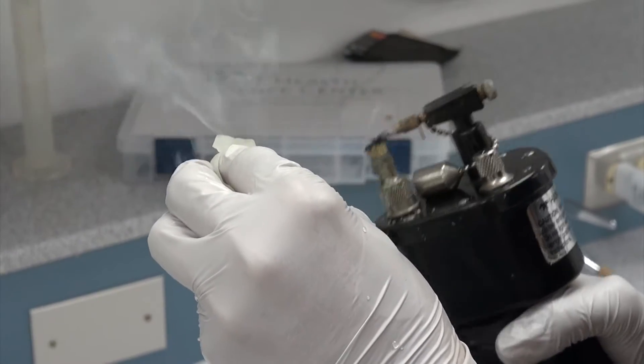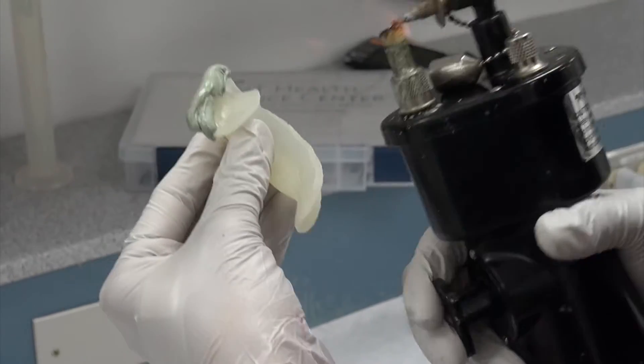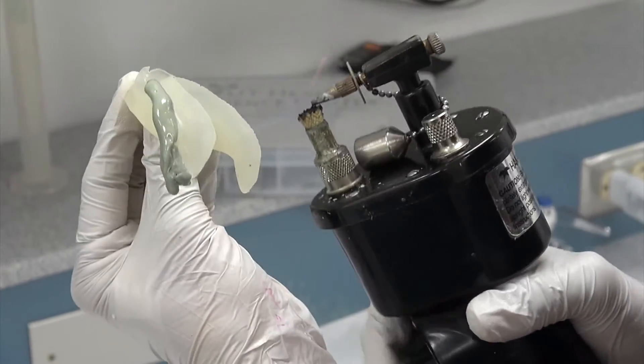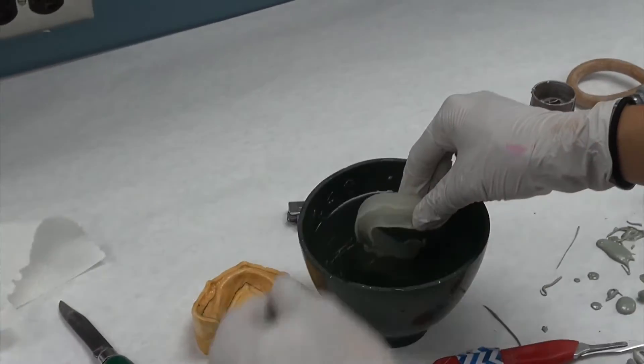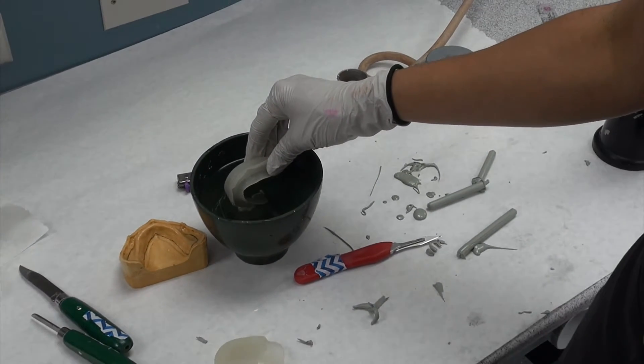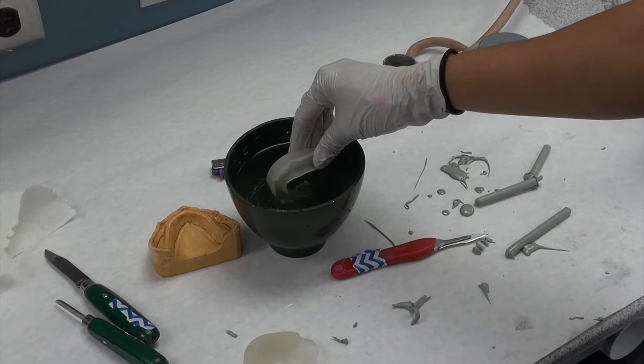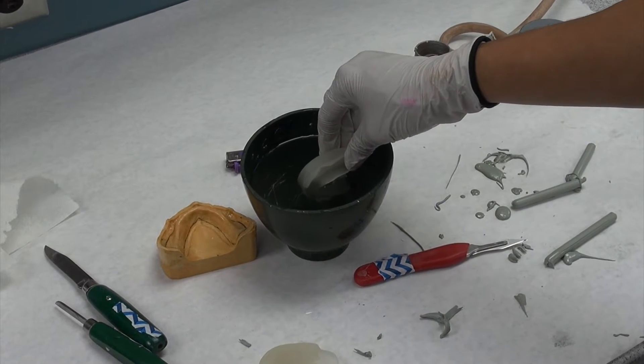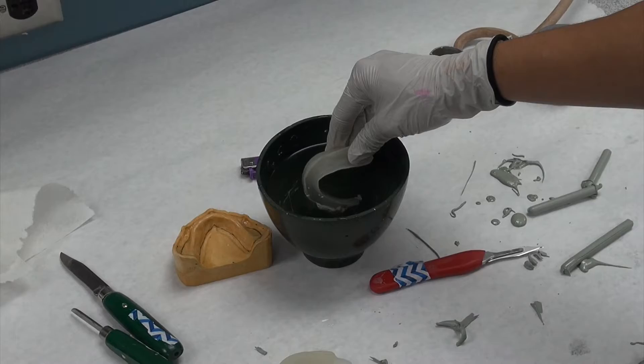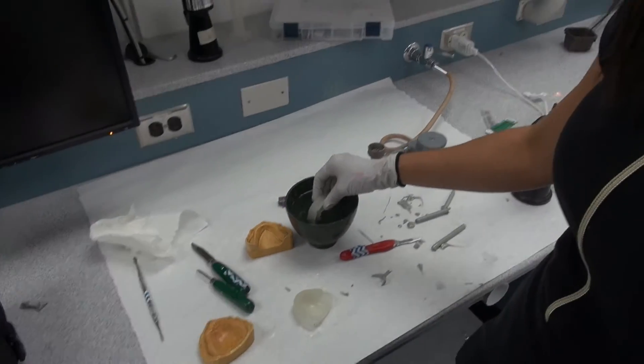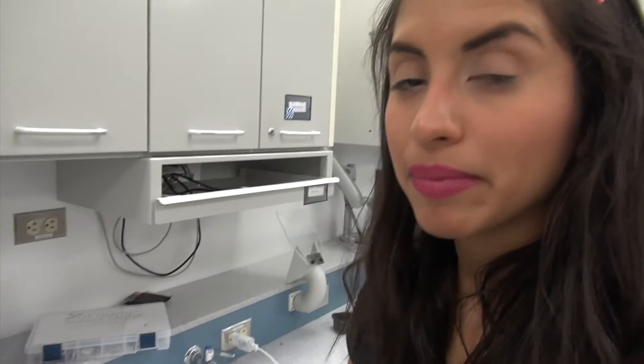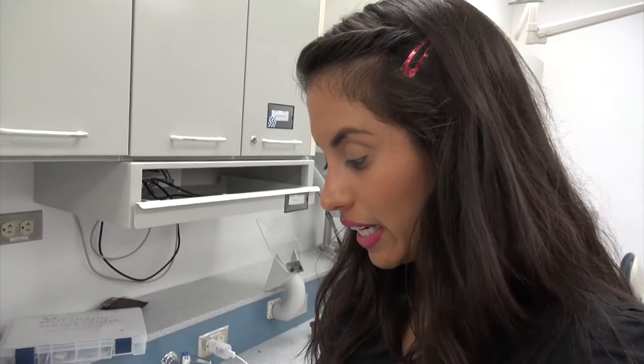Trying to minimize how much excess you have onto the lingual. You don't want it very thick and clumpy. Each time you apply the compound material, you want to heat it at a sizable amount and heat it about three to four times. Each time that you're doing it, you're trying to perfect it and get it a little bit more smooth.